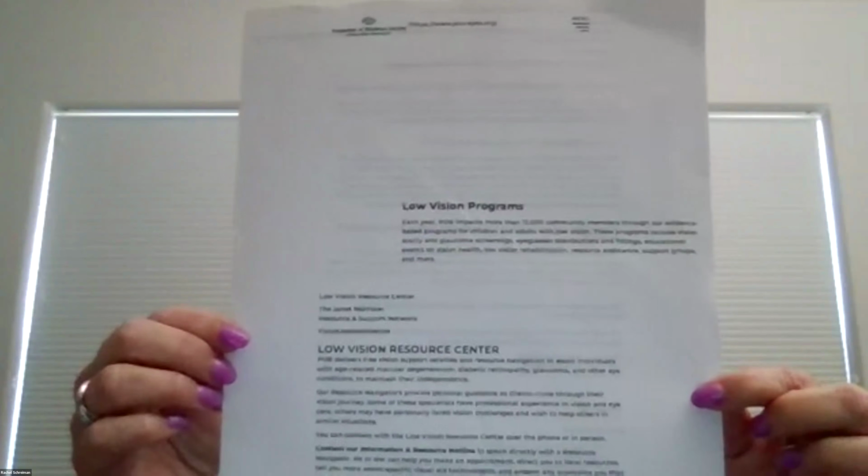The next thing I want to show you is the document reader, and this is where this app really does a great job. So I'm going to show you what it's going to read. I'm not going to tell you what it is. I want the app to do that. But this is a document. It's a 2-page document, front and back. It's very small print, or standard print, I suppose. But for all of us with low vision, it's very small print.